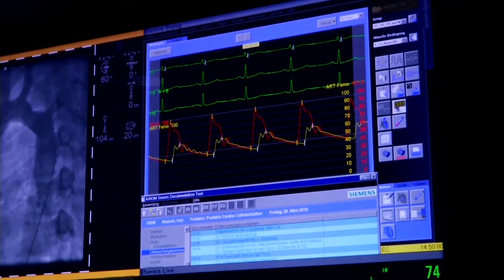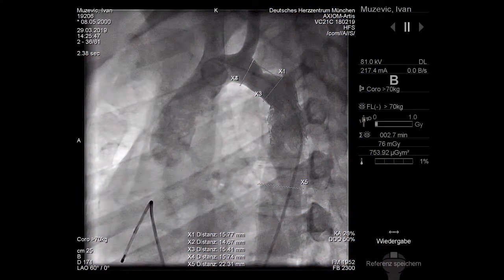And now we can switch to the angiographies, the B, please. And this is the angiography we did. And you can see that we really try to tackle this indentation between the left carotid artery and the left subclavian artery. The left subclavian artery is only a little bit visible, but in the next picture we don't see the carotid. So the diameter under this sedation is about 15 and something, so let's say almost 16 millimeters.